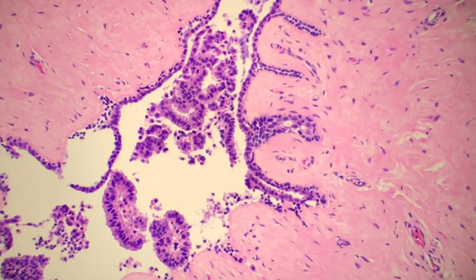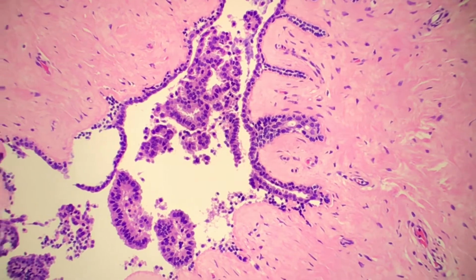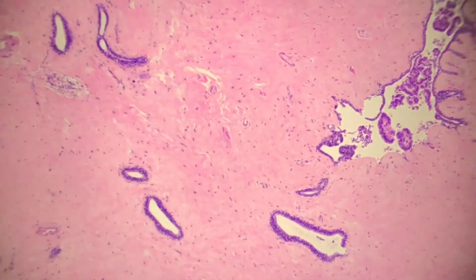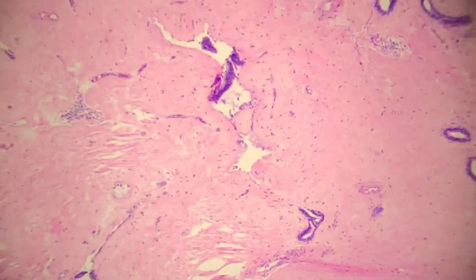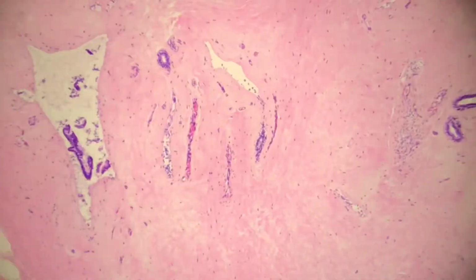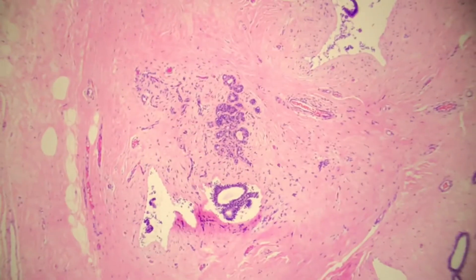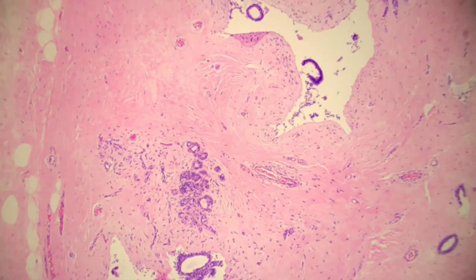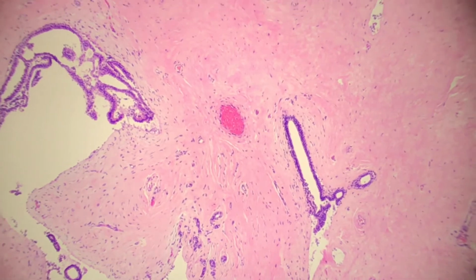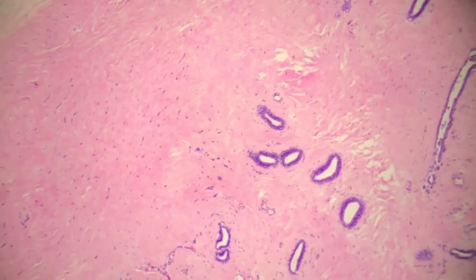So this particular fibroadenoma has some components. There are some features suggestive of involvement by papilloma. There's no atypia in this papilloma, so if you left it at fibroadenoma, that would be okay, since it's completely excised. Okay? So that's our general gist of things. Rare things for you to see in fibroadenoma.